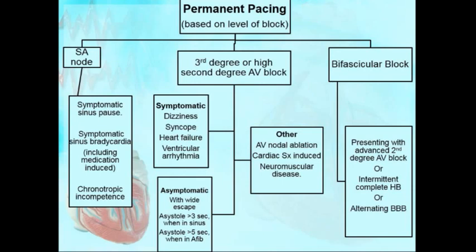We're all, me and Dr. Bhatija, are scrubbing and getting in. And they hook up the telemetry before we start the cath, and boom, there is complete heart block, you could see it. And I said, show me the inferior wall STEMI. And everybody got excited seeing a big inferior wall STEMI, but there is a beautiful complete heart block underneath the inferior wall STEMI. And that's because of the right coronary artery.